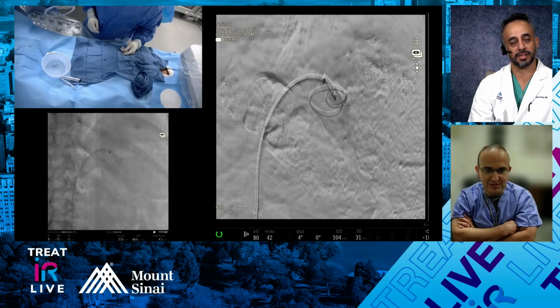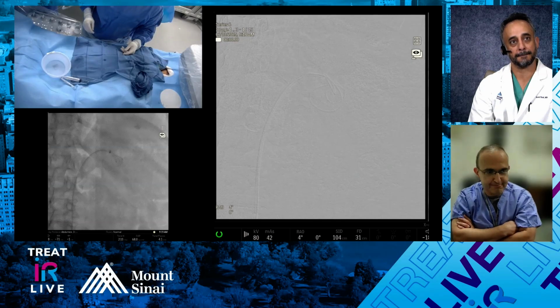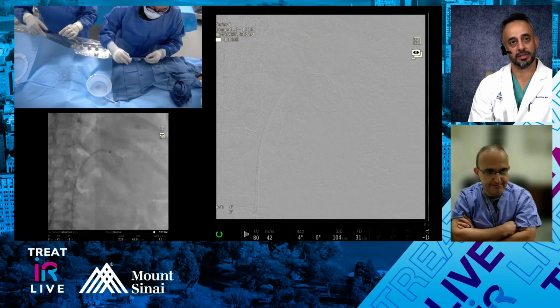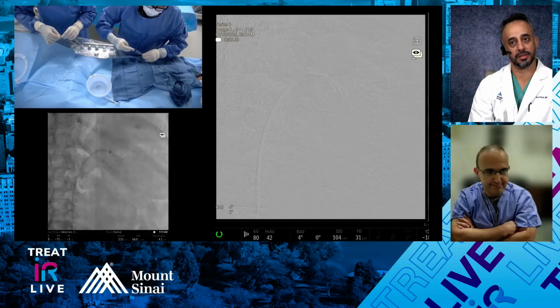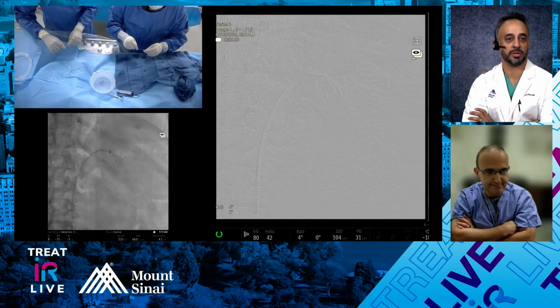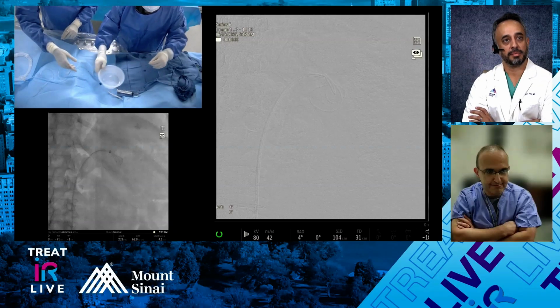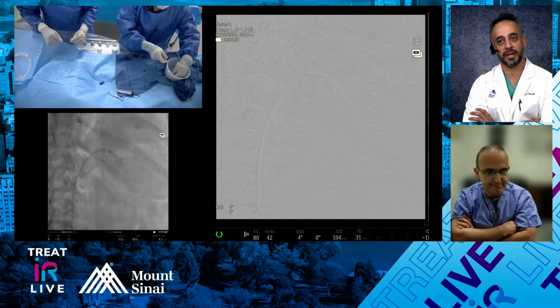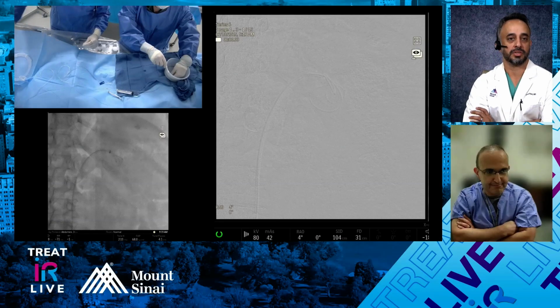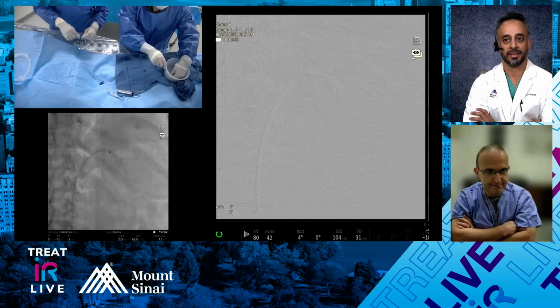Now, thoughts, both of you, with that kind of size? Are we talking fibered or non-fibered? Is there a difference? How does it feel, either of them? Depends on what you prescribe to. I think in terms of data for aneurysms, most of it's from neuro, and in terms of durability, they're unfibered coils, looking at packing density. That 24 to 27% packing density, on the peripheral side, we don't really do that. And it's a little bit different because we can also coil the inflow, which obviously in neuro you can't really do.